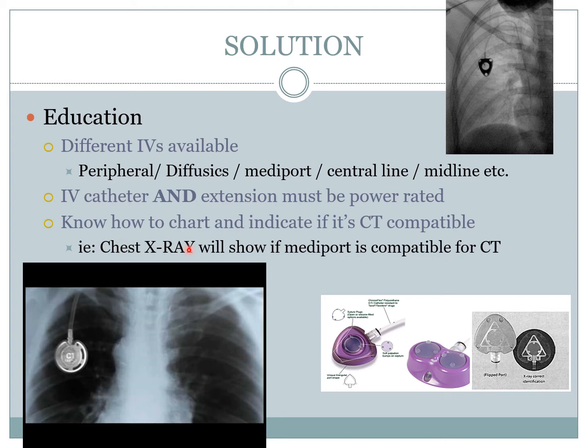Know how to chart and indicate if it's CT compatible. Yes, charting is very important. Nurses chart all the time. And that's so everyone's on the same page. We chart, we keep up to date with what's going on with the patient, and anything we put on, what gauge, needs to be charted, so that it's a way of communicating to everyone who's working for the patient, and that way the workflow can go smoothly.